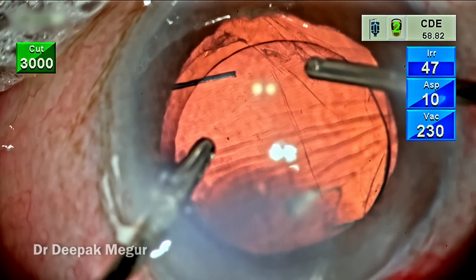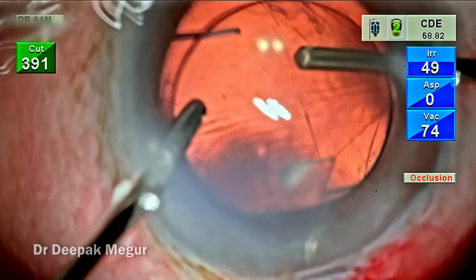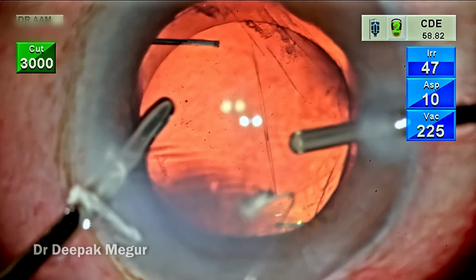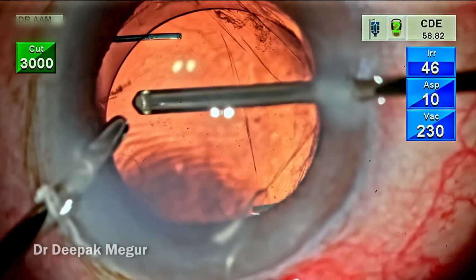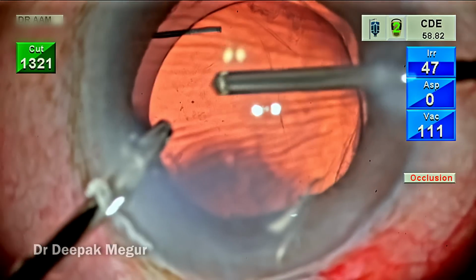The lens continues to remain stable, although it is not in the best centered position, but this is what we are going to get. We don't have an intact rhexis, so we can't achieve an optic capture. We're placing a large multi-piece lens in the sulcus, so it is still better than most other alternatives. The vitrectomy is continued. I'm just trying to find out other areas.